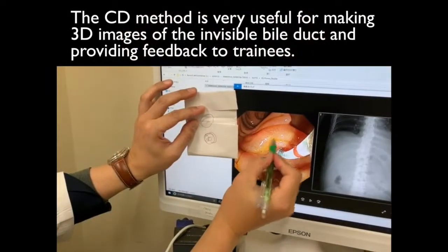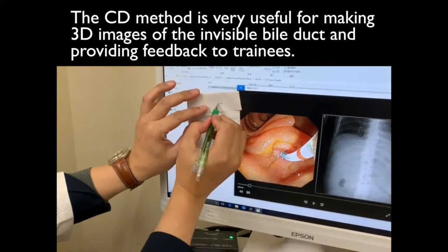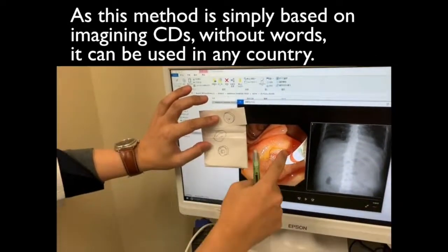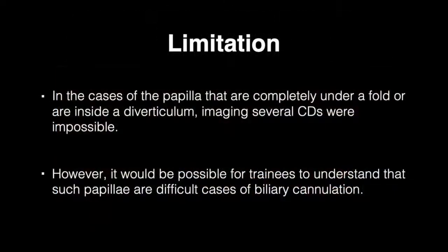The CD method is very useful for making 3D images of the invisible bile duct and providing feedback to trainees. As this method is simply based on imaging CDs, without words, it can be used in any country. As for limitations, in the case of papillae that are completely under a fold or inside a diverticulum, imaging several CDs is impossible.